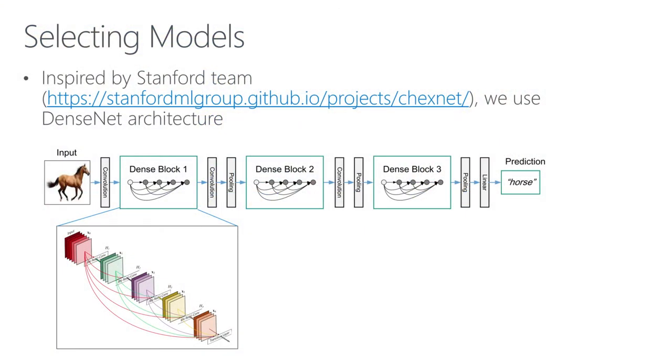Fantastic. So tell us a little bit about these. You call them DenseNets. What makes them more powerful? So if you think about it, if you have trained a very deep neural network, like we just talked about, the gradient will vanish very quickly, right? So the way that DenseNet overcomes it is that it has a few dense blocks, and in each dense block, it's saying, instead of passing all the gradients layer by layer, why don't we have a common place to put all the gradients there so each layer can take a look at all the feature maps in the previous layers? So in that case, it solves the vanishing gradient problem because every layer can access the information in all the previous layers.